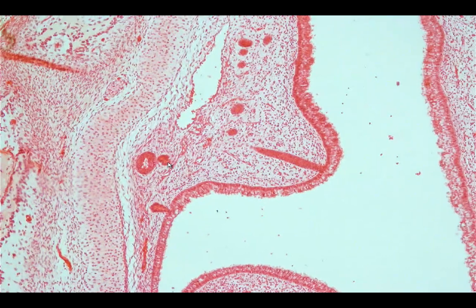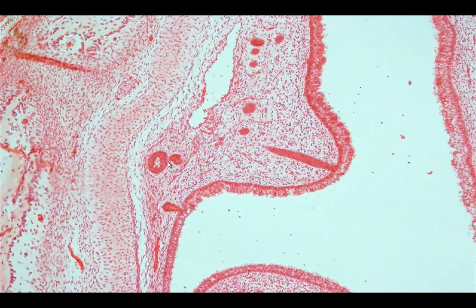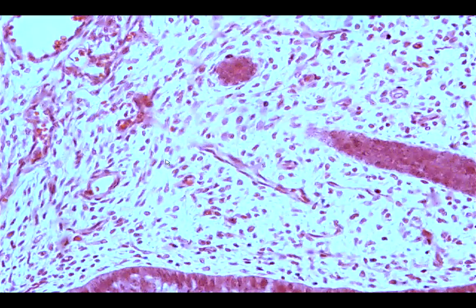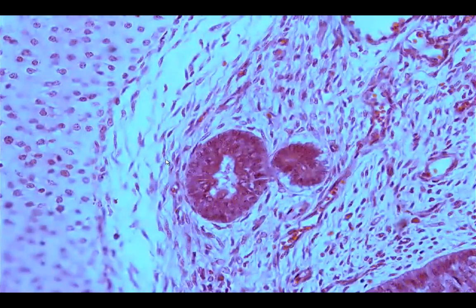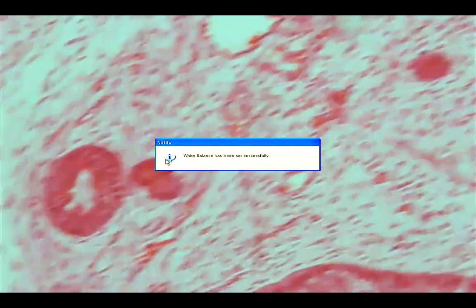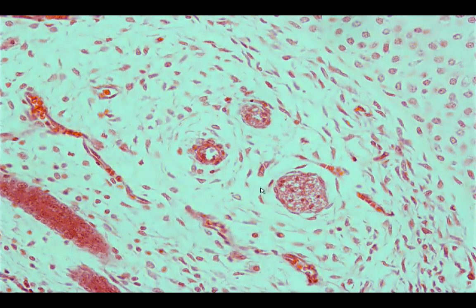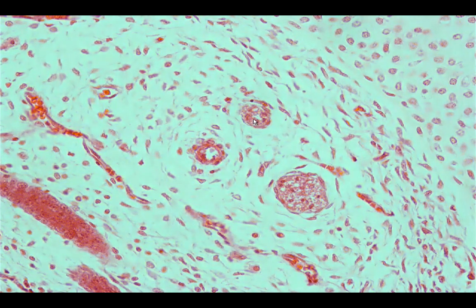Other structures visible in the olfactory region include the presence of glands, which we call olfactory glands or Bowman's glands. They are branched tubulo-alveolar glands. Sometimes you would see lipofuscin granules, which are yellow-brown. There are also nerve structures called the fila olfactoria.